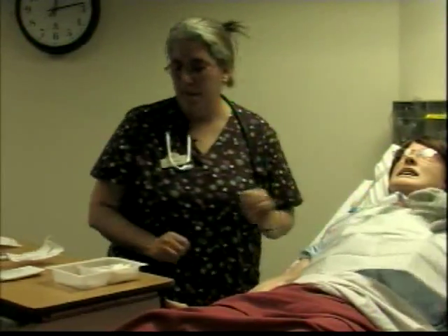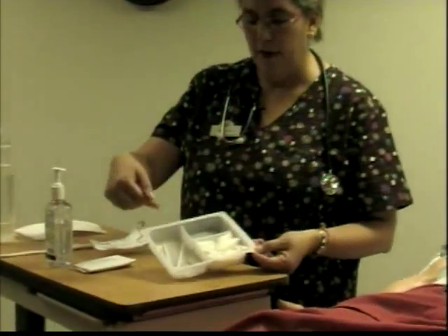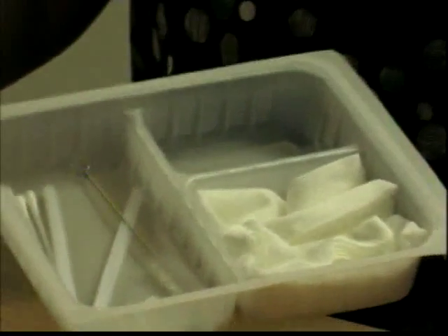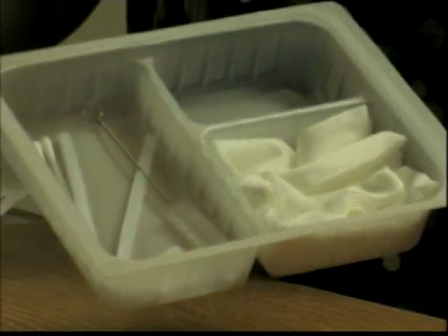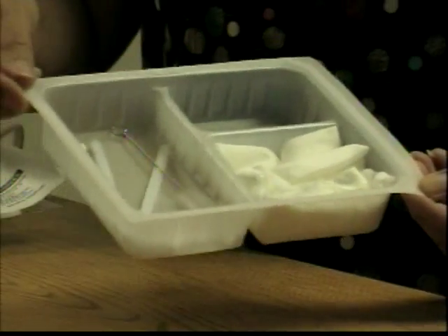Okay, right there. And then you're going to have a variety of things in here. You're going to have cotton tip applicators. You're going to have your split gauze, and I'm going to show it to you when I put my gloves on, and any other extra 4x4s to help you clean, and a reservoir in here for your saline.